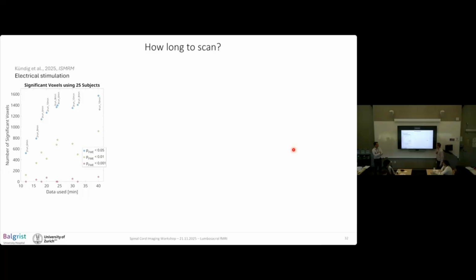You have an equivalent of 20 minutes, but let's say you try multiple runs, like 4 runs that you make shorter, like 5 minutes, 5 times 4, just to see how it compares. That we did not check. The minimum duration we use is 6 minutes, but here we could check 4 times 5, just to see how it compares to what Alexandra was saying. For us, this is the best comparison because it's exactly 24 minutes, and the difference is so small. But again, it's 6 minutes versus 8 minutes, so it's quite different.